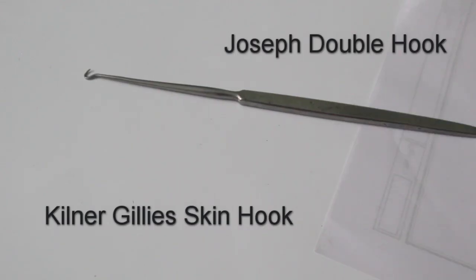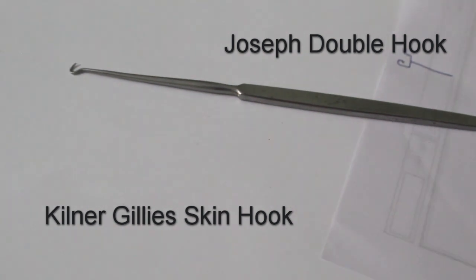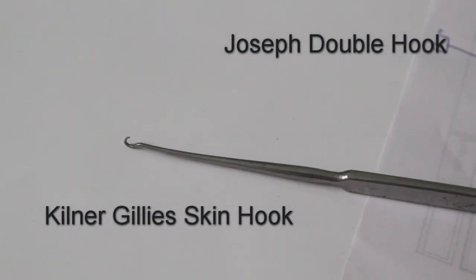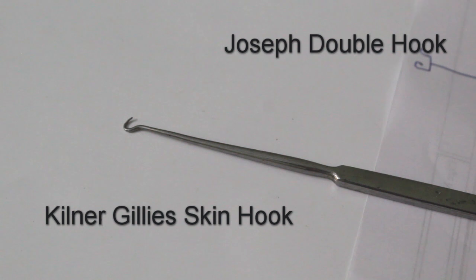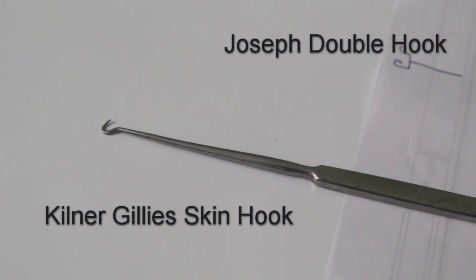This is a skin hook — a single hook, specifically a Kilner-Gillies hook. If it is a double hook, there will be two hooks instead of a single hook. When it is a double hook, it is usually called the Joseph hook.